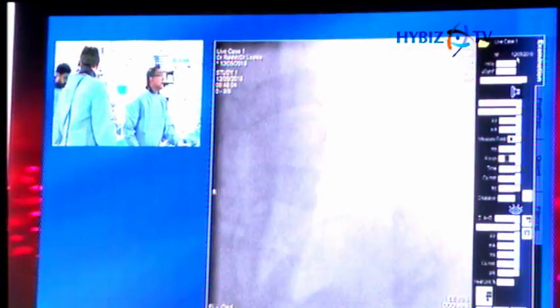We're just giving the patient a little bit of morphine just to settle him down. He's actually got a combination of back pain, and then I think we'll post-dilate, so let's take the 3.5. But the ECG is silent.